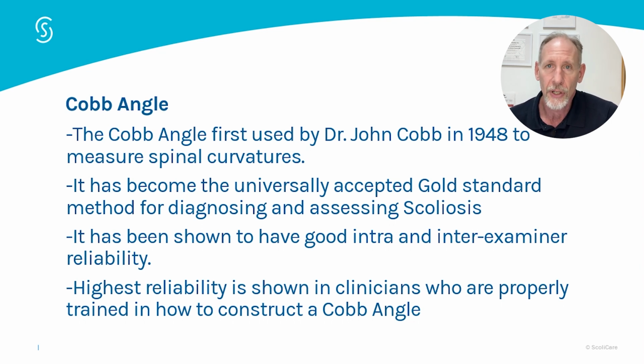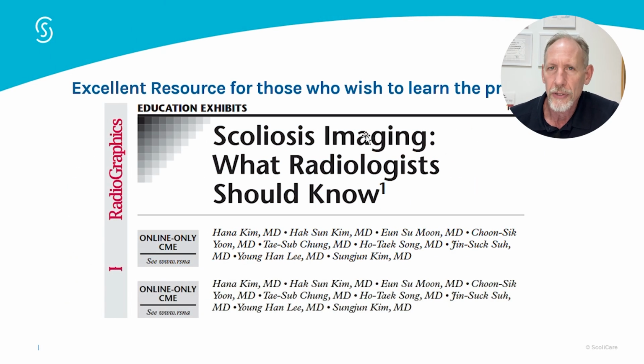It has been shown to have good intra and inter-examiner reliability, and the highest reliability is shown in those clinicians who have been properly trained in how to mark the Cobb angle. If you want a great resource for how to assess scoliosis images and also how to mark Cobb angle, this is a great one in Radiographics entitled Scoliosis Imaging, What Radiologists Should Know. It's in their November-December issue in 2010.